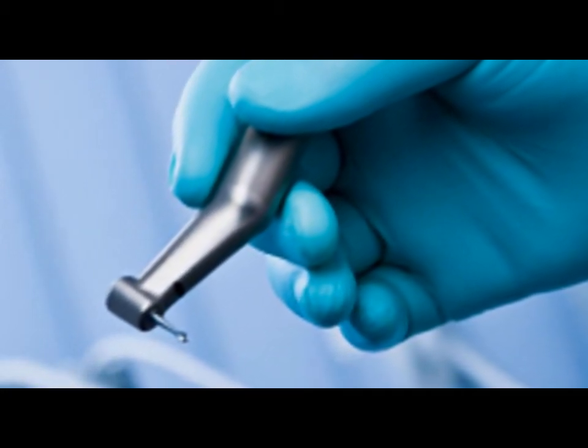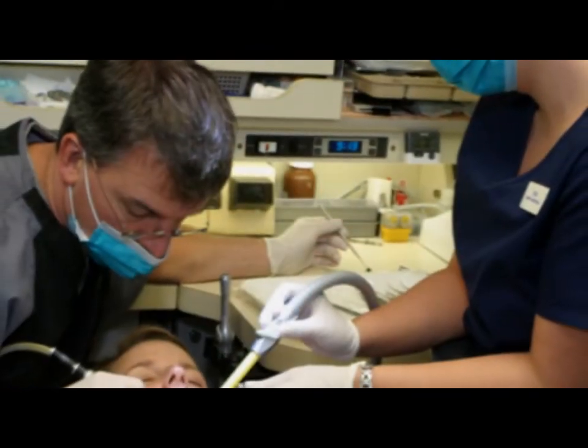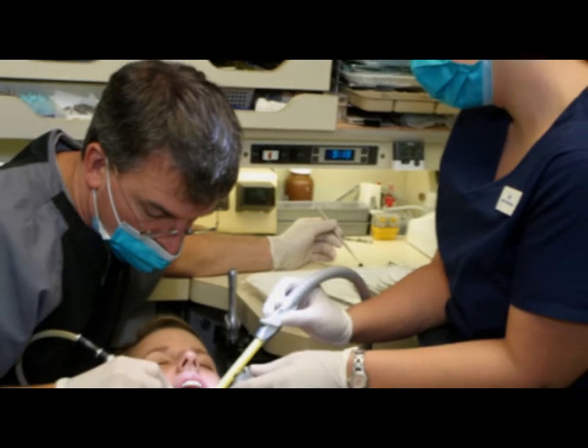After the decay has been removed from your tooth, a cleansing gel is applied. Next, a bonding solution is applied, finally followed by the composite filling material.